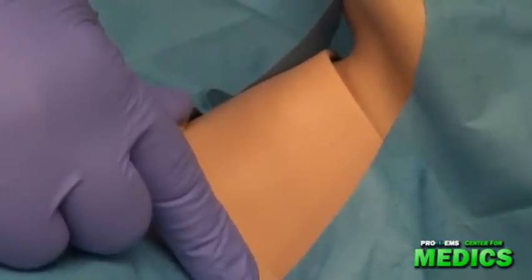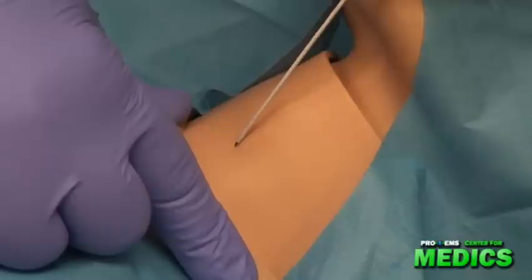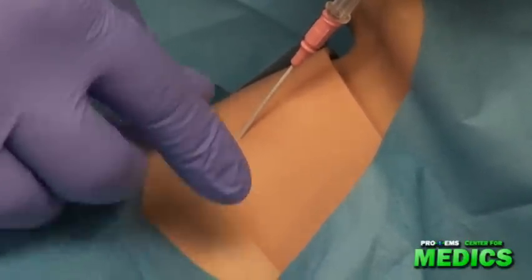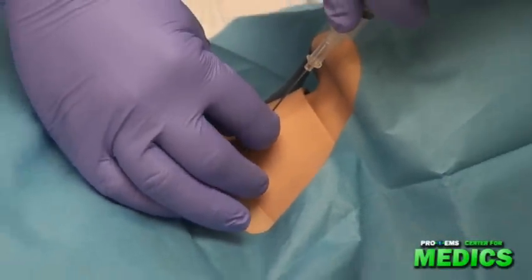Next, using an 18 gauge needle and syringe, I'm going to pierce through the skin and the cricothyroid membrane, aspirating as I do so, until I feel a sudden pop. I am now going to advance the catheter until it is flush with the skin and I'm going to maintain control of it.